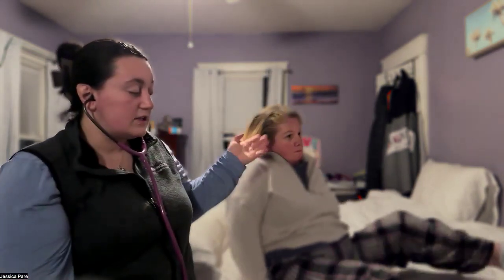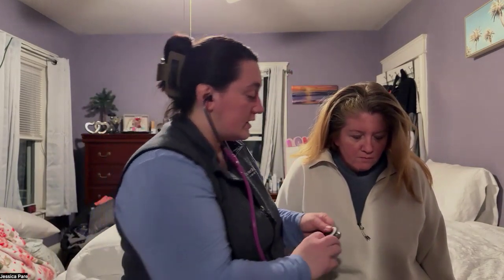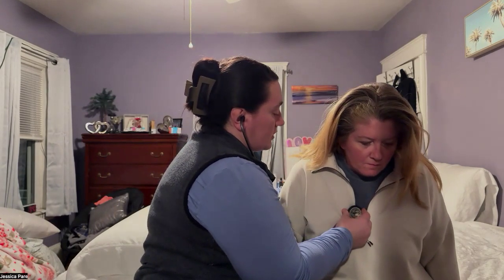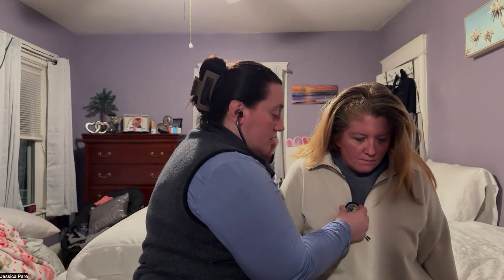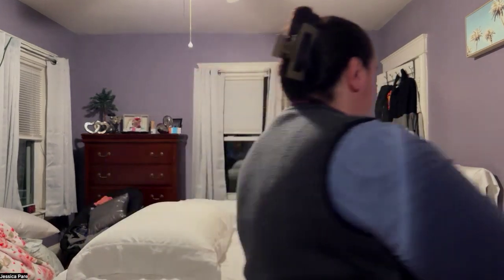I'm then going to have you sit on the edge of the bed, and we're going to lean forward a little bit. I'm going to have you take a deep breath and hold it while I listen for any aortic regurgitation. And hold. And no regurg heard. All right, so that completes our cardiac assessment.